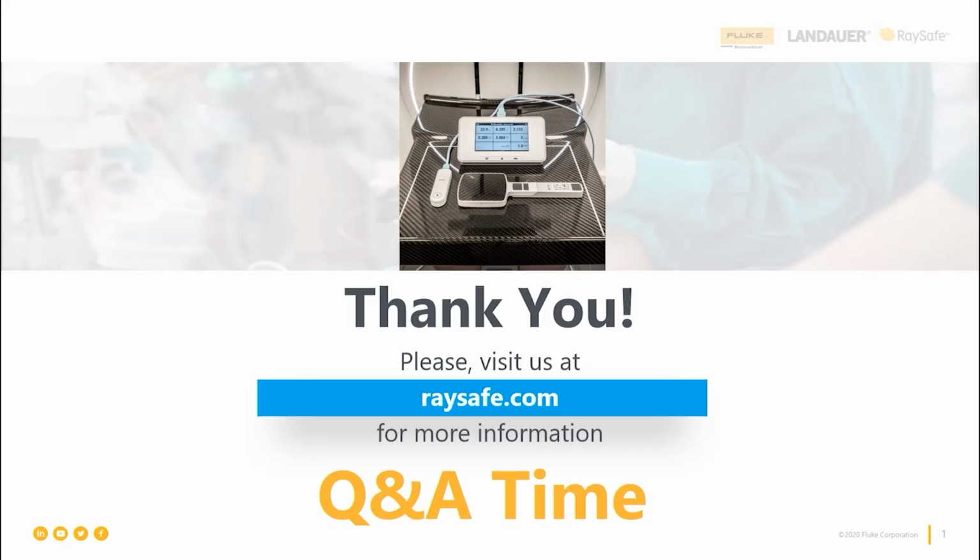First question up is, do the RaySafe dosimeters Xi and X2 measure kerma or absorbed dose? Yeah, they are measuring in air kerma and not in absorbed dose.